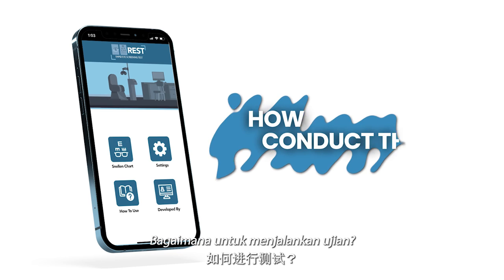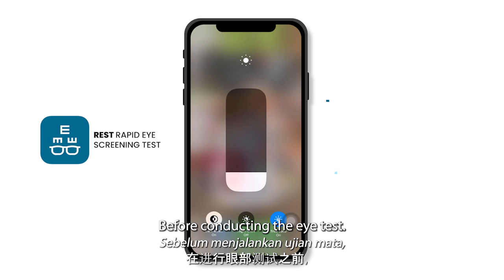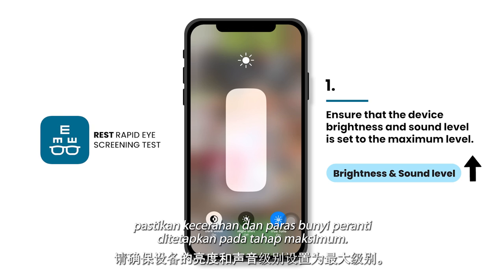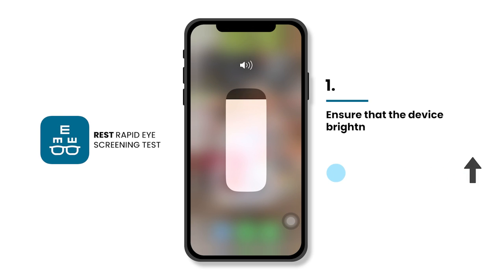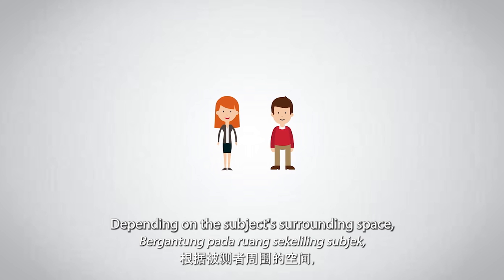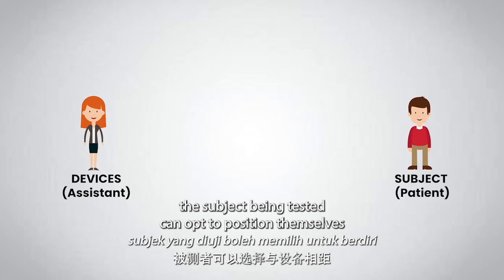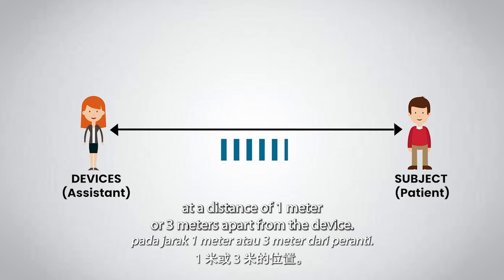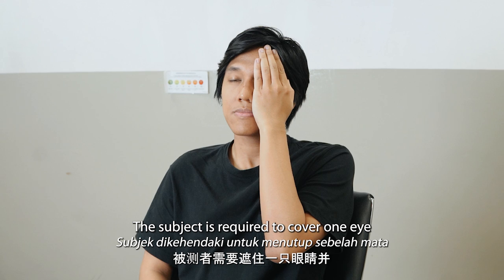How to conduct the test? Before conducting the eye test, ensure that the device brightness and sound level is set to the maximum level. Depending on the subject's surrounding space, the subject being tested can be positioned at a distance of 1 meter or 3 meters apart from the device.